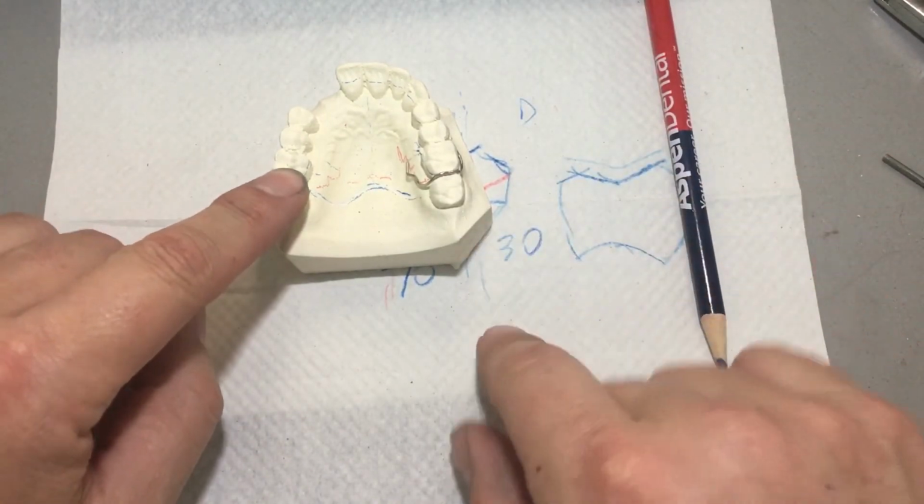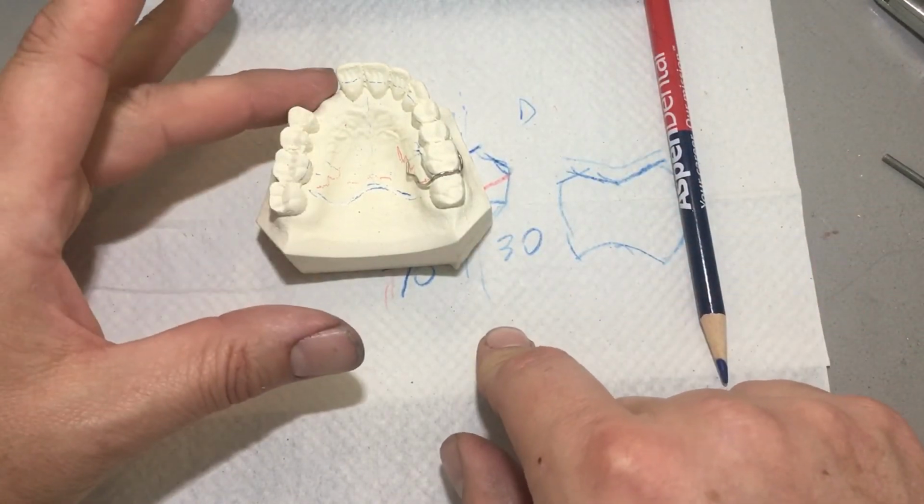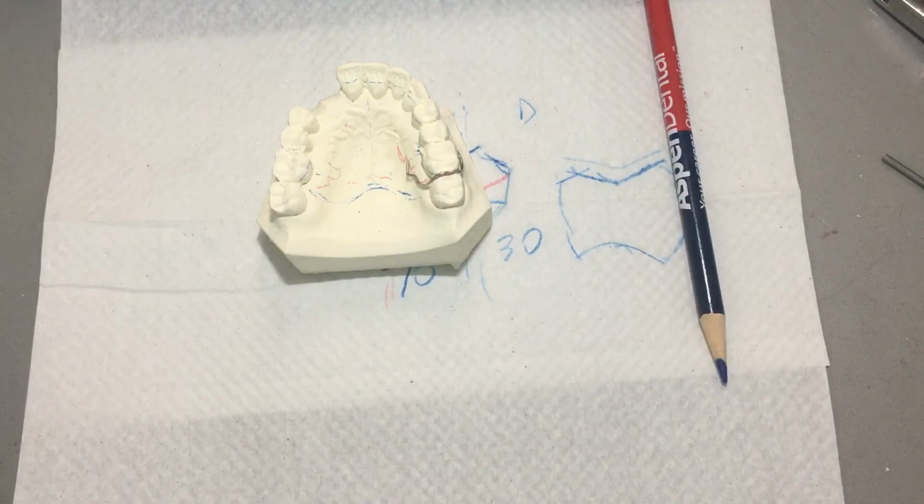So I'm going to continue on with the other wire and continue on with the setup. Now, you sitting there and watching me bend a wire is not going to help you. What's going to help you is getting your pliers and creating this prosthetic today. Now, is it due today? Impossible. Although, if you are technically inclined, this is no more than an hour and a half. A couple of wires, 2 teeth, cold cure, trim and polish. But we've got 40 some odd of us in here, and we're beginners.